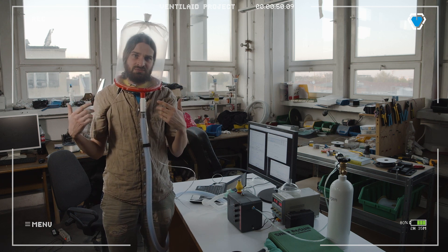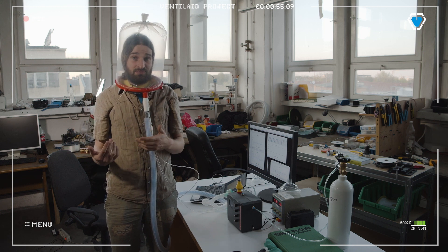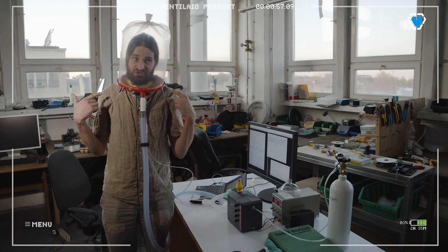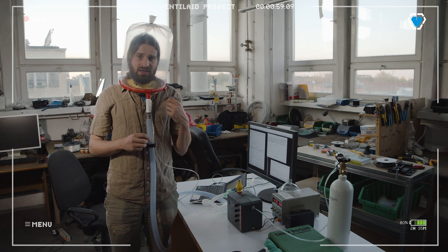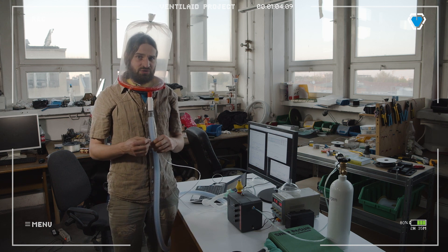They tend to be on short supply nowadays. So we decided to find a way to build them. Building this — this is the third prototype. I think it takes, at a prototyping speed, something like half an hour to build one.